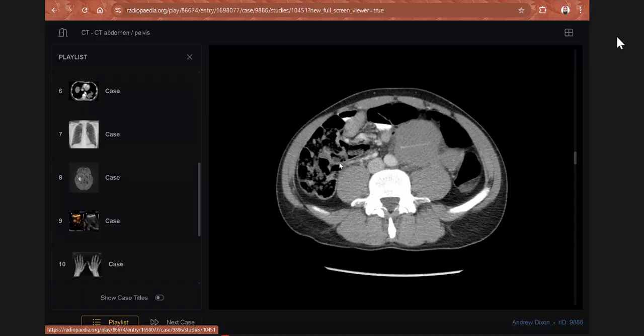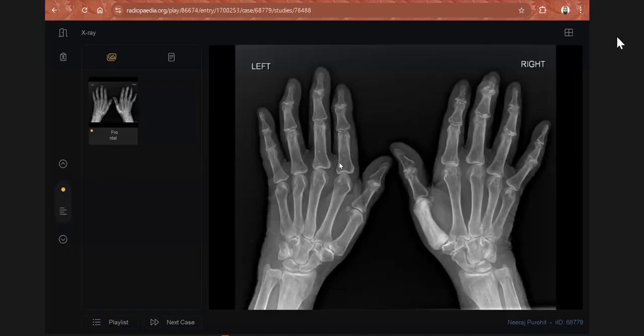So this was your first case. Very good. You described the arthritic changes. Actually there is a distal polyarthropathy involving the mid and distal interphalangeal joints. But I think the most important is this one, this pathology.